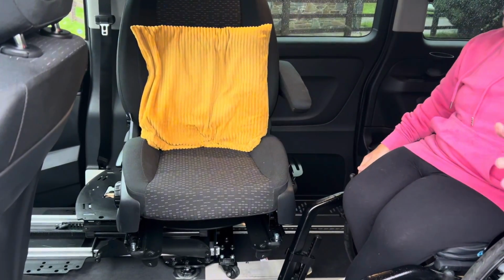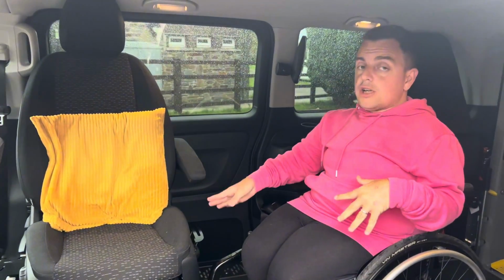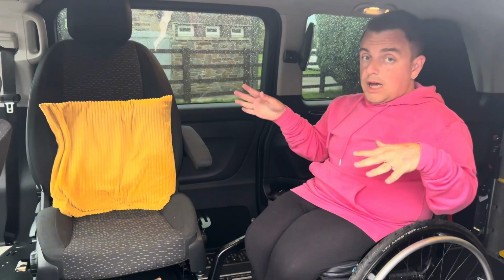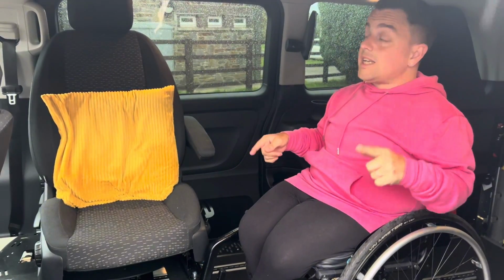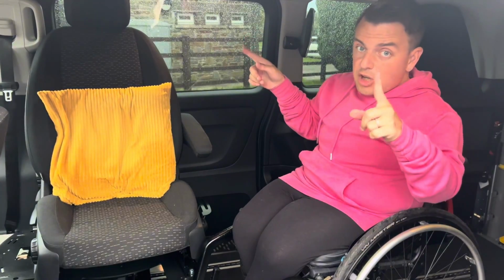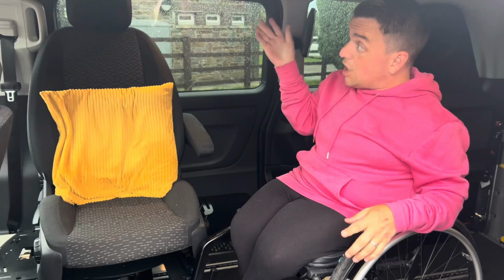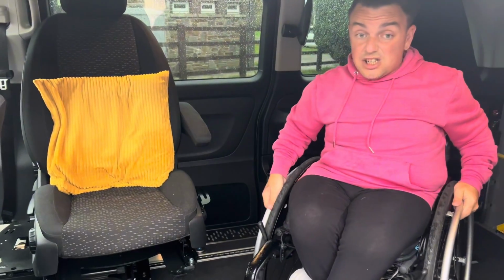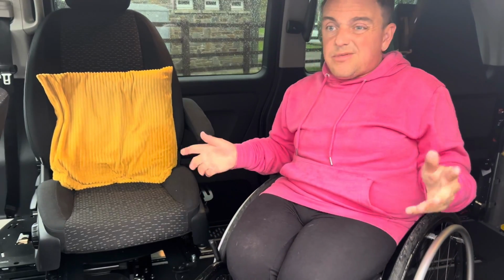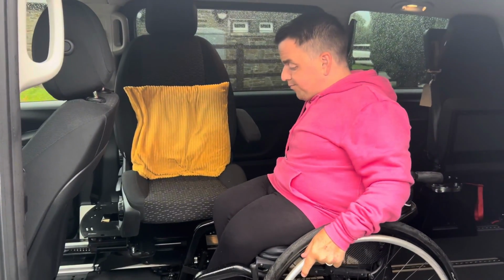It's perfect. One thing I would suggest personally is if you don't need it that high, you can actually lower the height of the seat, which again I'll show you in a sec once I'm on. Reason being is because the headrest, the only fault I have found with this van, brushes up against the roof of the van. Wouldn't make a difference really, I don't suppose, but just me being a neat freak.